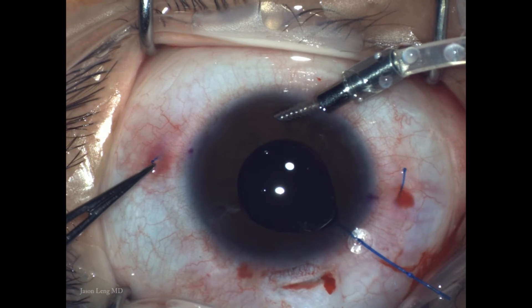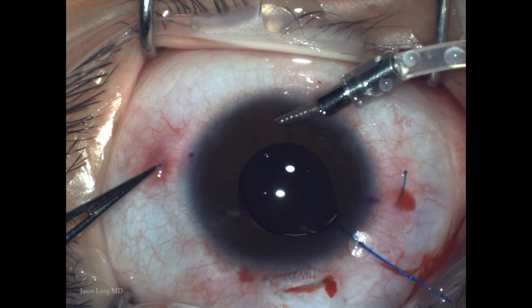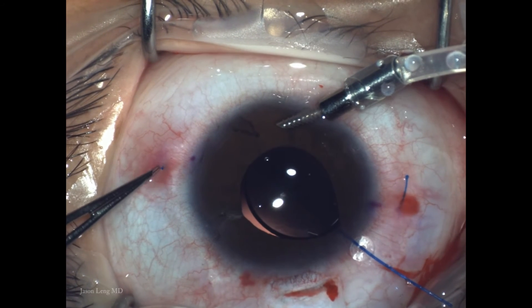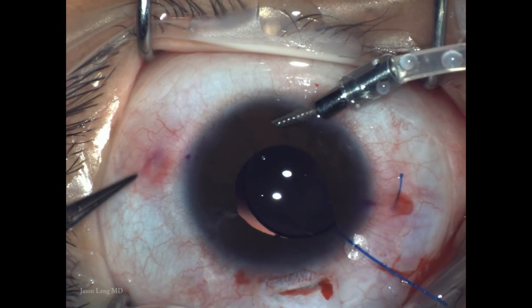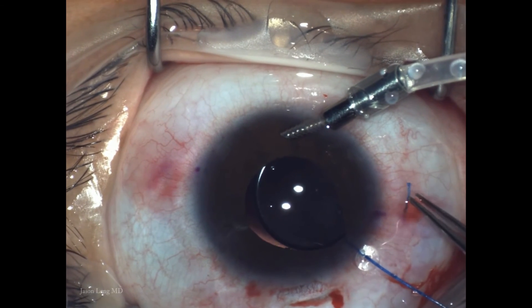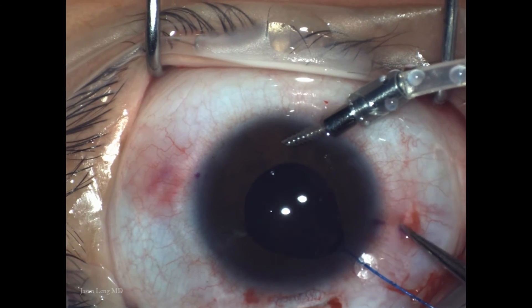Next I'm tucking the haptics back in — I want the flange to be intrascleral. I'm using quite a bit of force with 0.12 forceps to push it in, because I don't want the flange sitting on top. With the flange in place, you don't have to worry about the haptics going back into the eye.